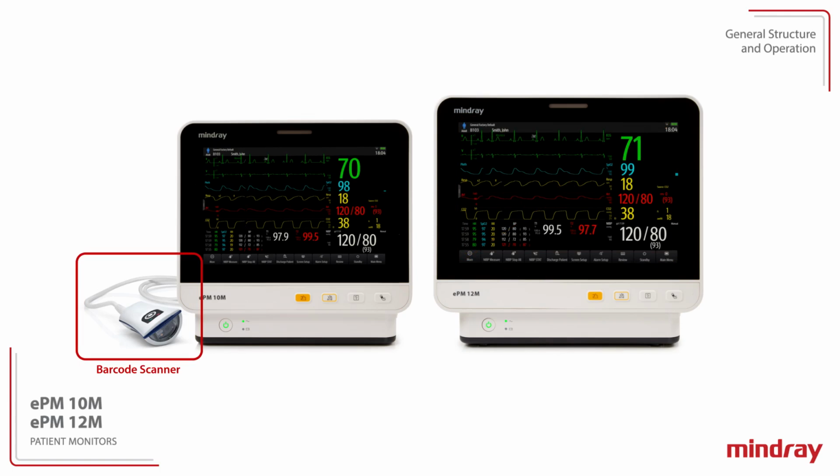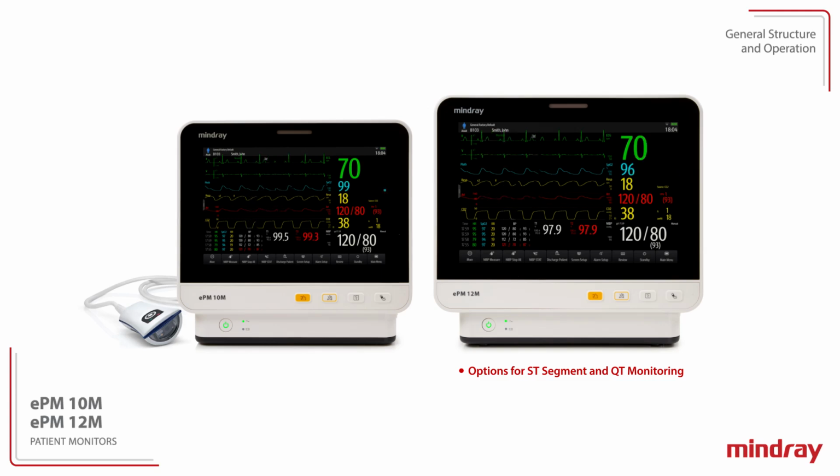The barcode scanner is an optional feature to support integration of patient demographic information with the ePM 10M and 12M patient monitors. The ePM 10M and 12M patient monitors include arrhythmia analysis with options for ST segment and QT monitoring in the ePM 12M monitor.